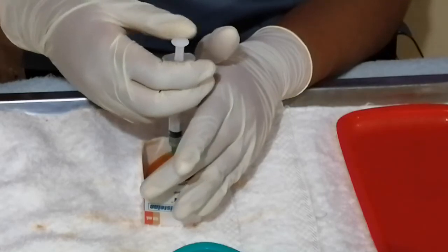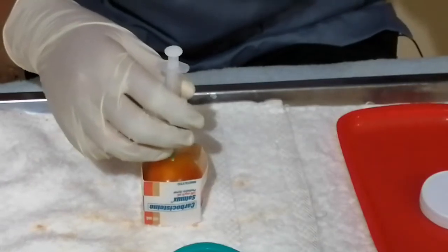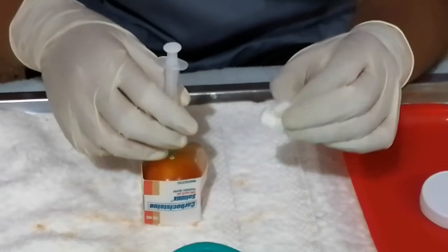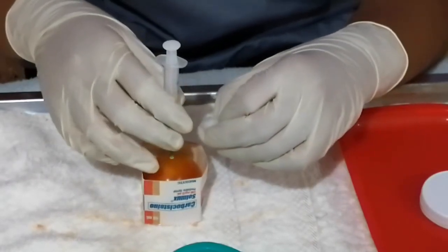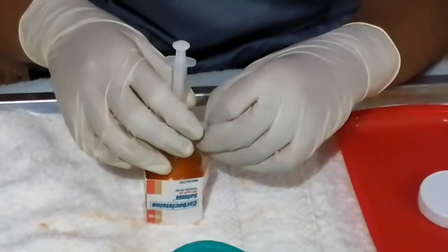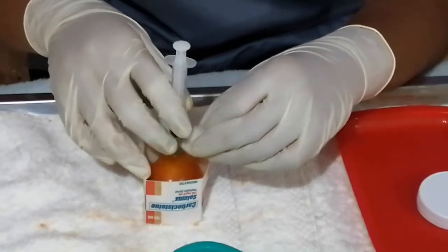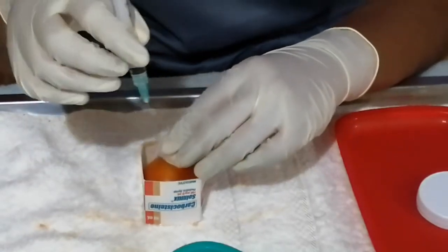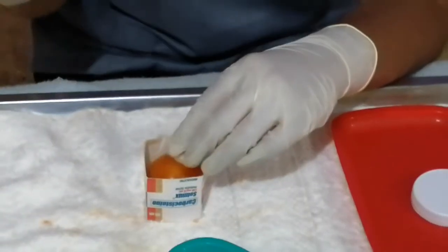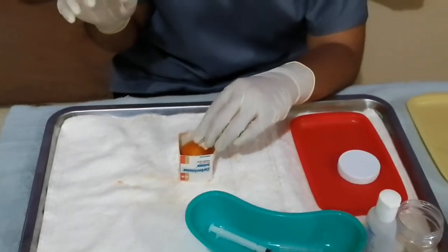Next, we're going to remove the needle by pulling the entire syringe straight out of the muscle at the same angle that it was inserted, and we're going to release the skin to allow its return to its original position. We put slight pressure on it, and then we're going to pull the skin and soft tissue to cover the tract once it is released to prevent leaking.